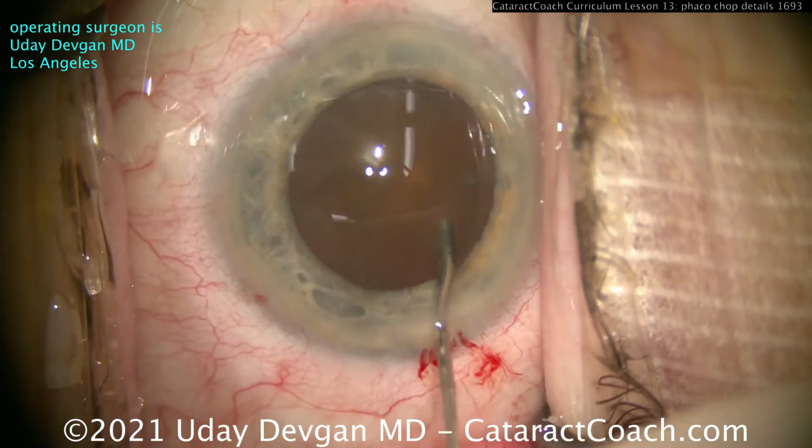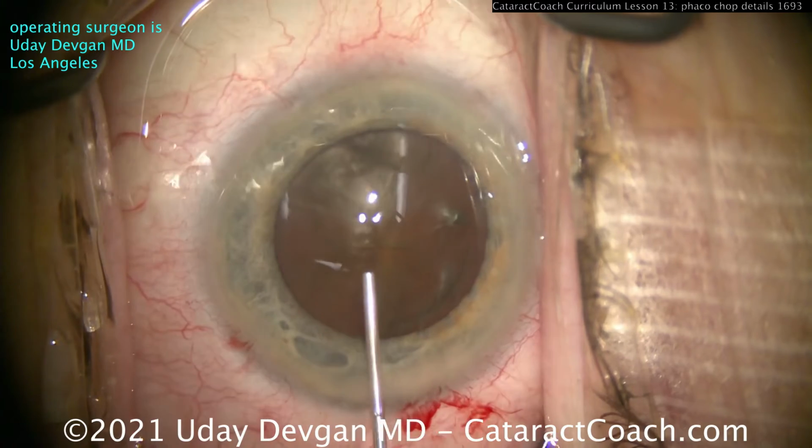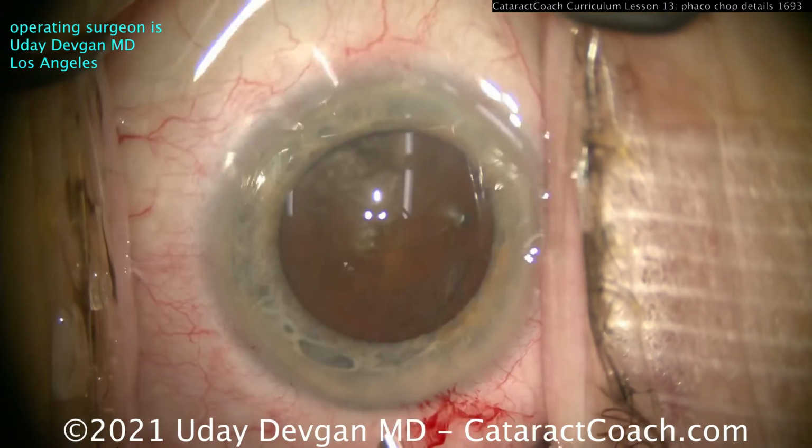Remember, if it does not spin, you will not win. Hey, you knew it. Good. So there's the nucleus. Got some good density, a little bit more viscoelastic to protect that central endothelium. Let's get the phaco probe in here.